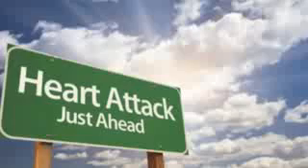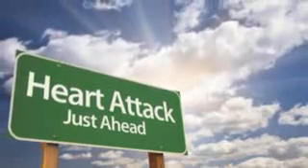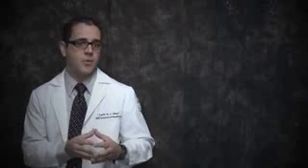Most people who have heart attacks have narrow or blocked coronary arteries. Thus, cardiac catheterization might be used as an emergency procedure to treat a heart attack. When used with angioplasty, the procedure allows your doctor to open up the blocked coronary arteries and prevent further heart damage. Cardiac catheterization also can help your doctor figure out the best treatment plan for you if you recently recovered from a heart attack but you're having chest pain still.